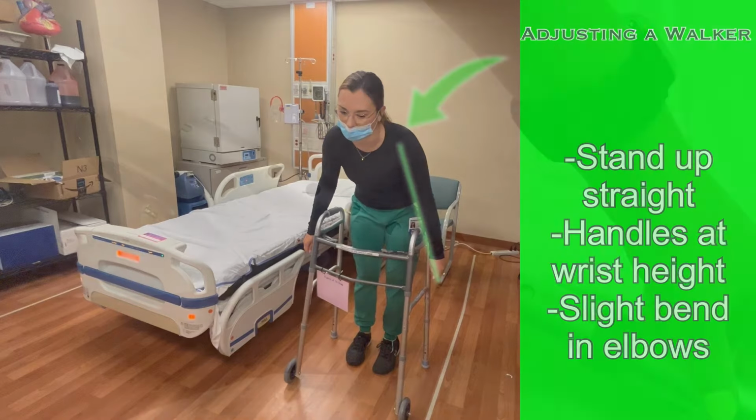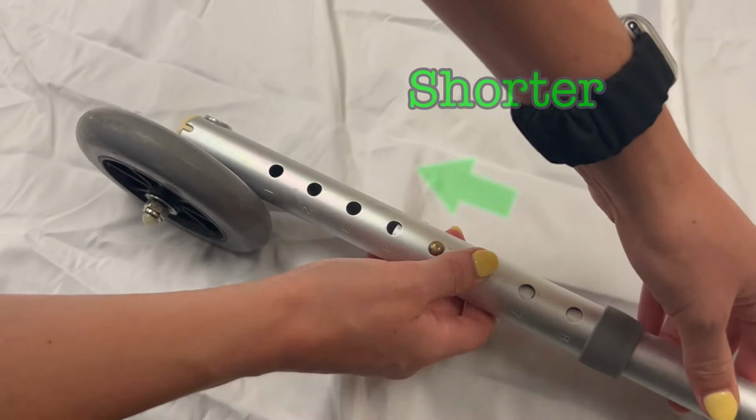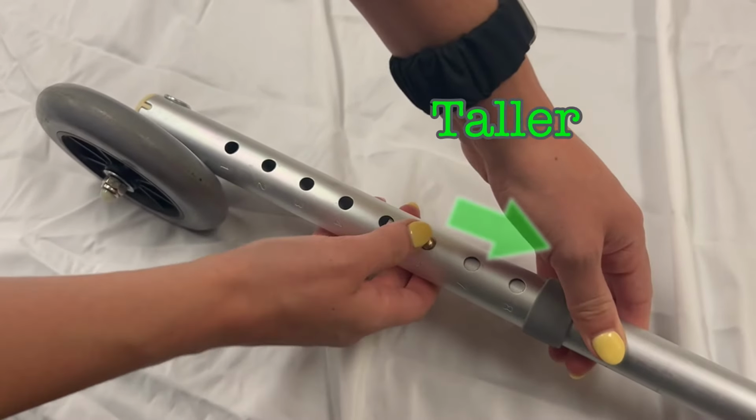To adjust the height of the walker, depress the button on the legs and slide the leg up or down until the button reappears in the desired opening. The closer the button is to the bottom of the leg, the shorter the walker will be. Further away from the bottom, the taller the walker will be.